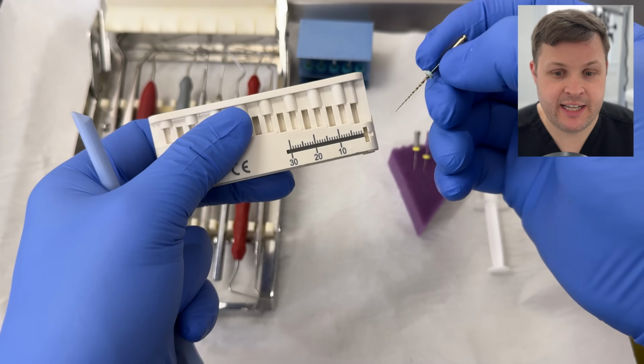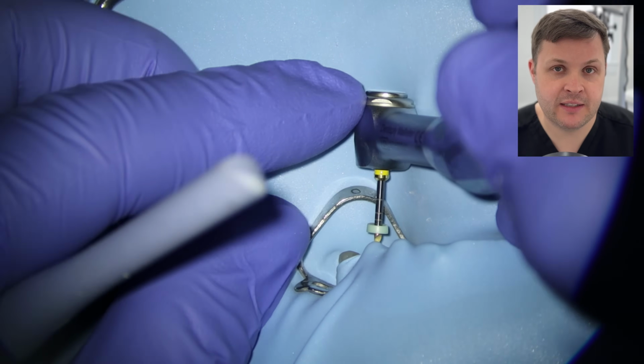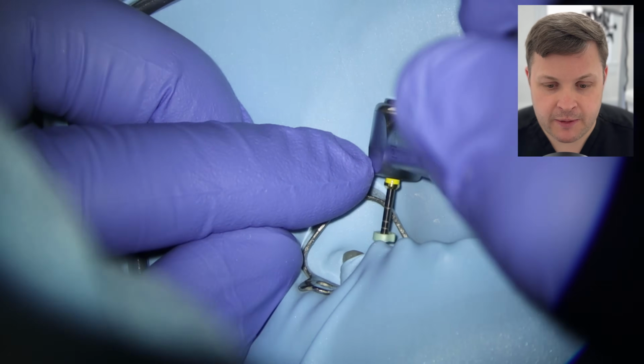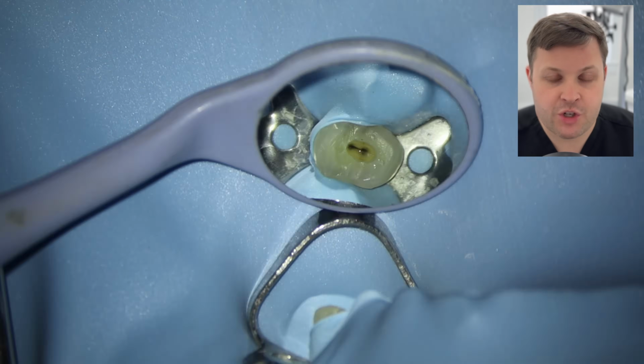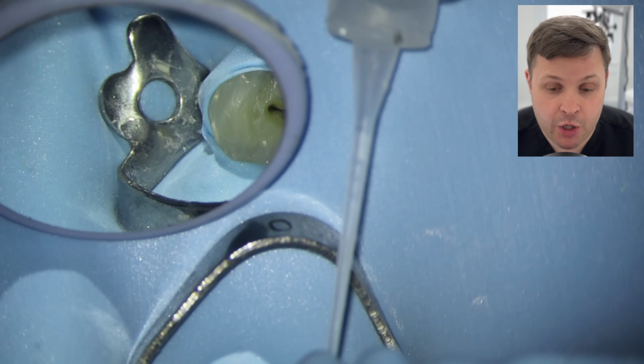Just do things in a nice process, and make sure you're just shaping things and not trying to rush. So this is essentially what we're trying to do. We're trying to release the grip of the canal space around the file so it negotiates.